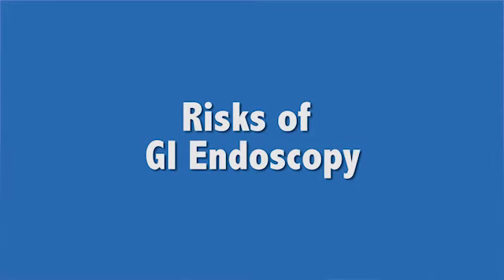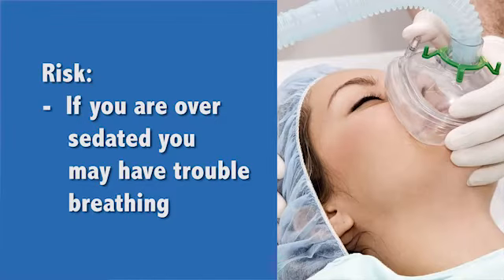Are there any risks with GI endoscopy? The endoscopy itself has almost no risk. The tube is flexible and easily maneuvered through the GI tract. Sedation is used for your comfort. Sedation does have some risk. If you're too sedated, you could have trouble breathing. And any kind of medicine has a chance of causing an allergic reaction.